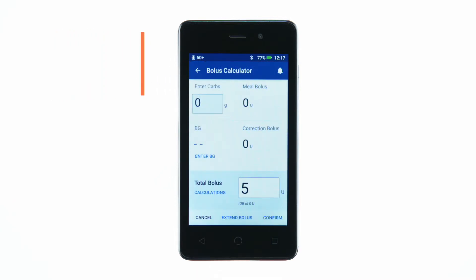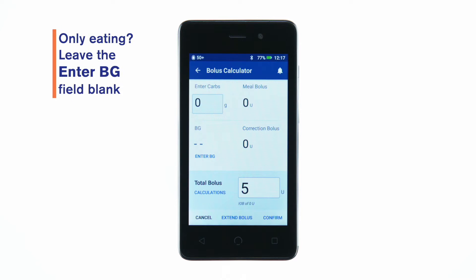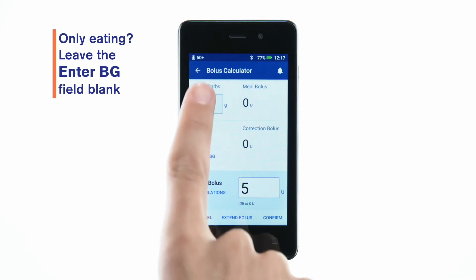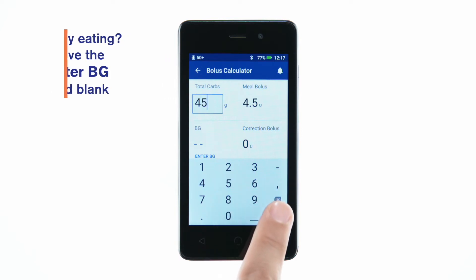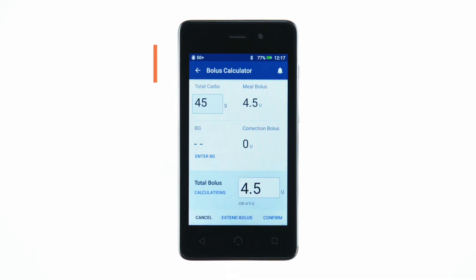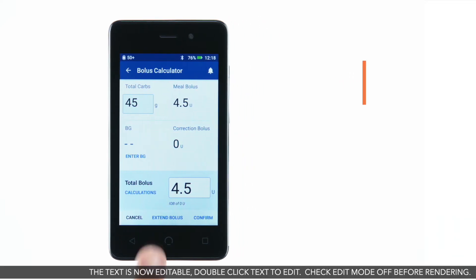If you'd prefer to have the bolus calculator calculate the bolus dose, tap the Enter Carbs field. Enter the grams of carbs and tap the check mark. Then enter a blood glucose reading by tapping Enter BG.